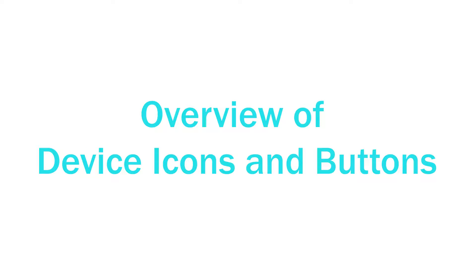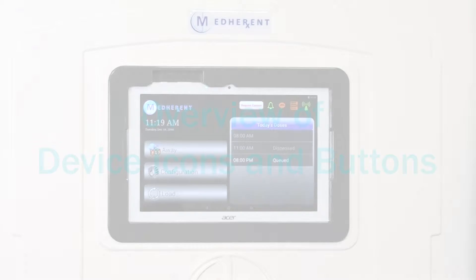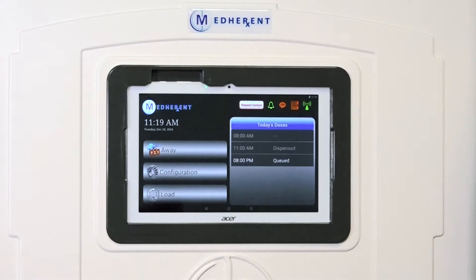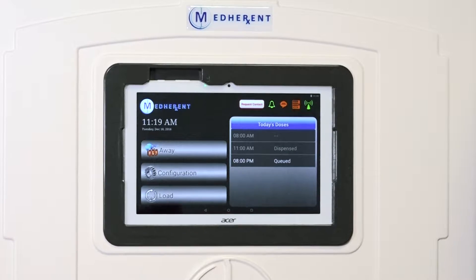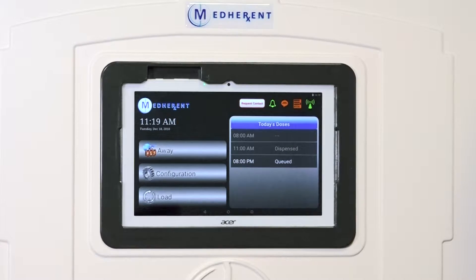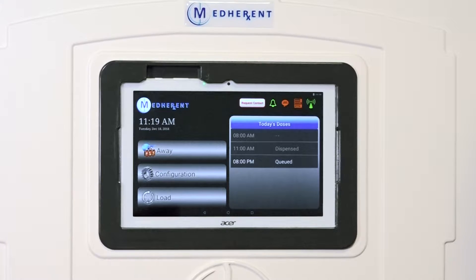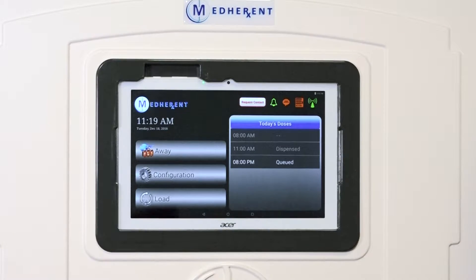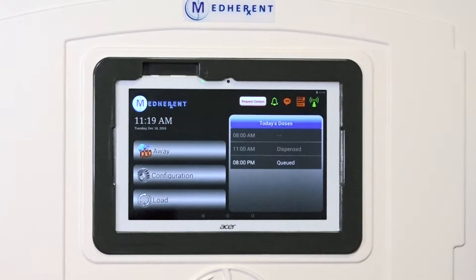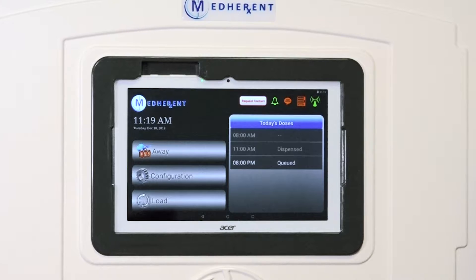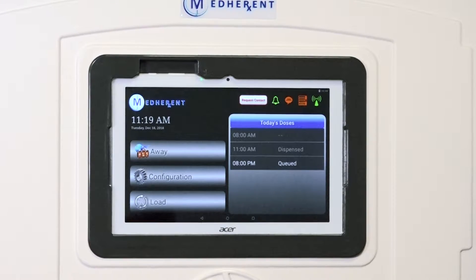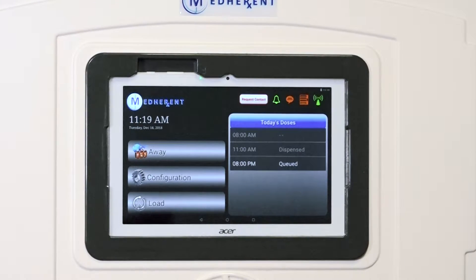Welcome to the first Medherent training module. During this module, we will review the various icons and buttons that can be found on and around the screen on the front of the Medherent dispensing device. Medherent is part of a remote medication management system developed by Terrapin Pharmacy to help ensure that patients or clients take the right medications in the right dosages at the right times.